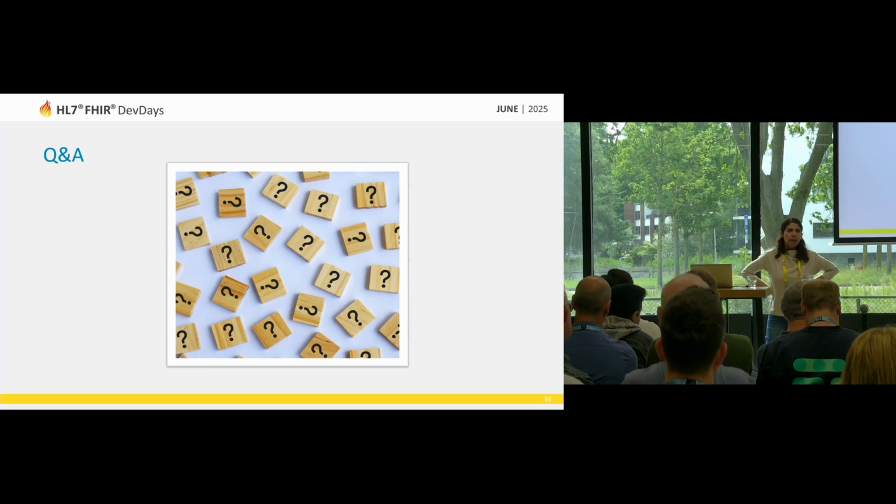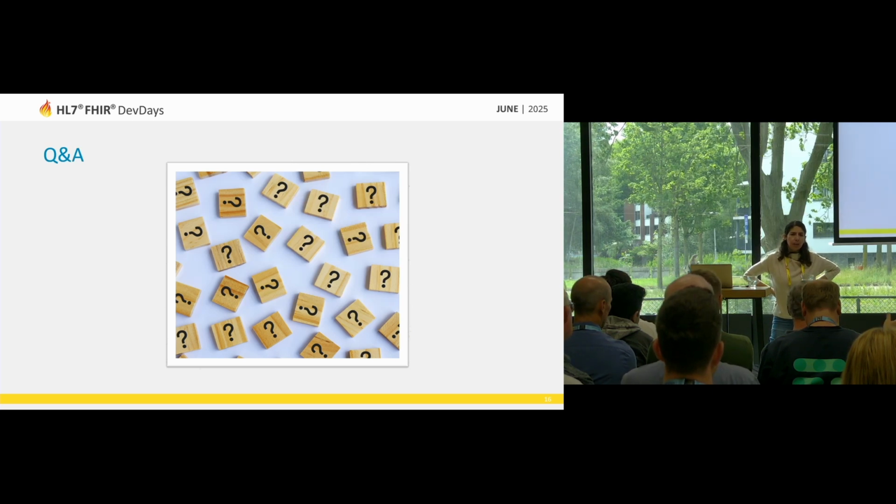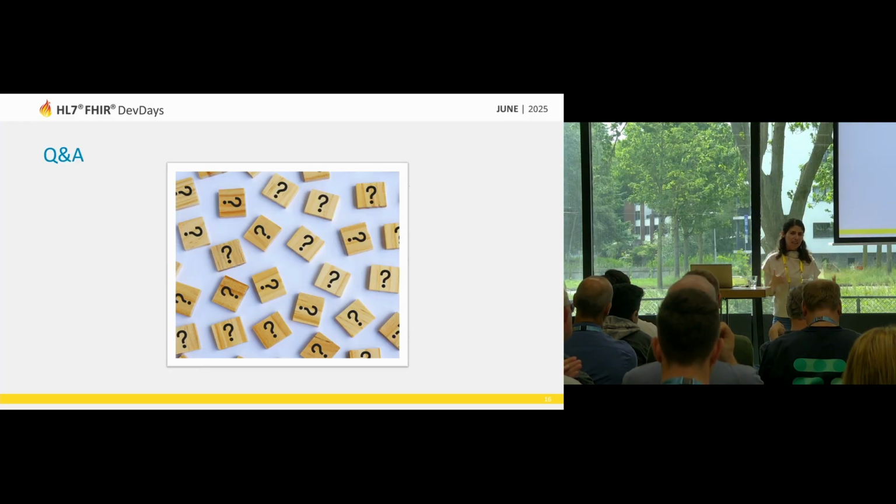To be fair, I haven't been in the last calls from the imaging integration, but as far as I am concerned, this is just the findings area. Their radiological report is very extended. You need to have also this technical information about technique and the dose and so on.